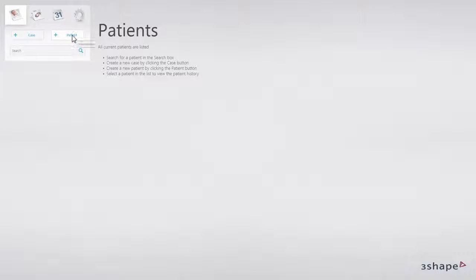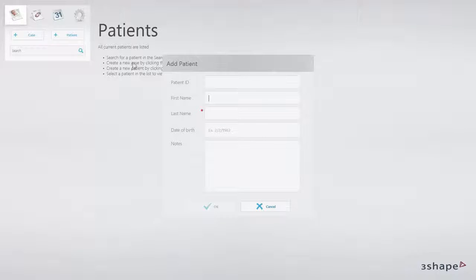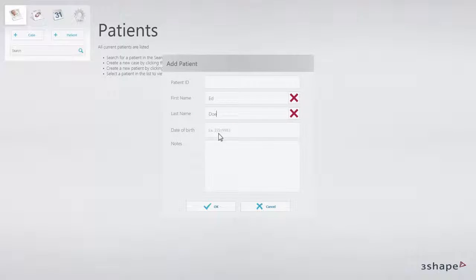To create a new patient, click Patient. Please fill out the required fields and click OK.